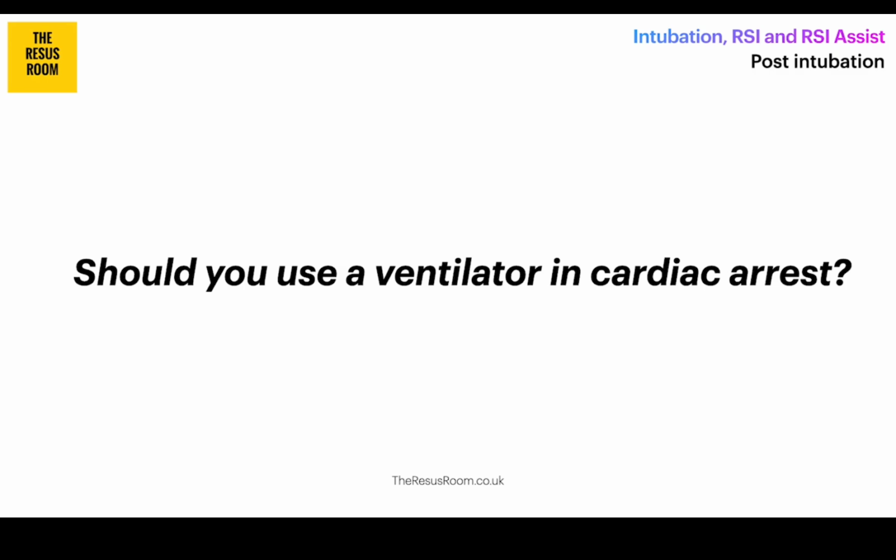Well, you'll be pleased to know that I think my thoughts echo yours very closely, Rob. Always nervous throwing it back at you. Close. But no, you're right. I don't think I can think of a situation where I would immediately put a cardiac arrest patient onto a ventilator. But I've certainly used it in the situations you've described, particularly hypothermic patients who we've got on the LUCAS and we're transporting into hospital. Definitely have used it then.